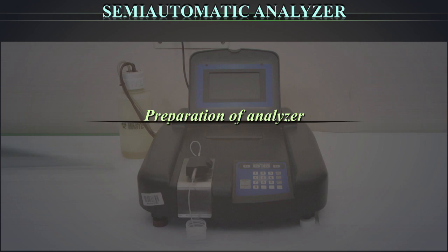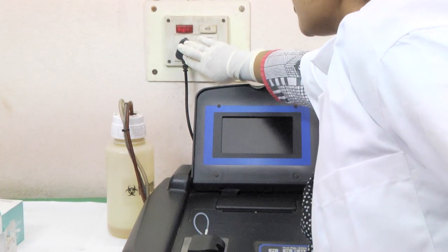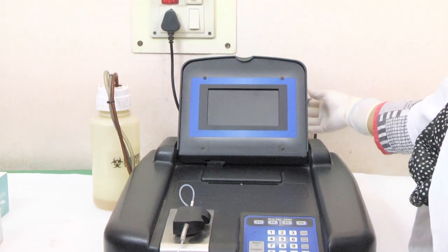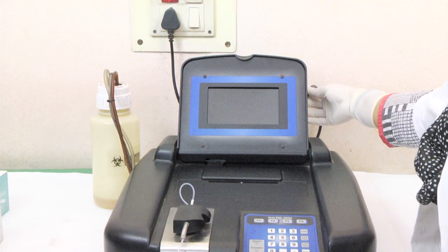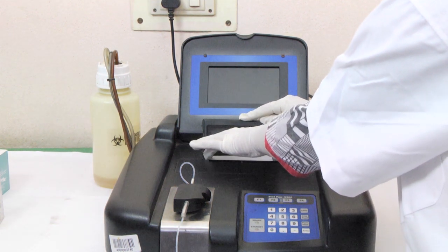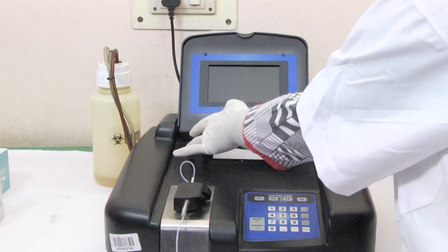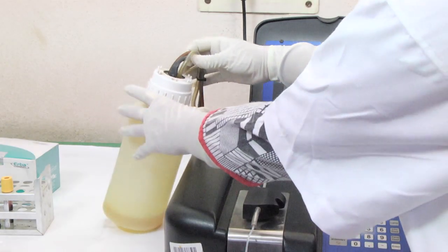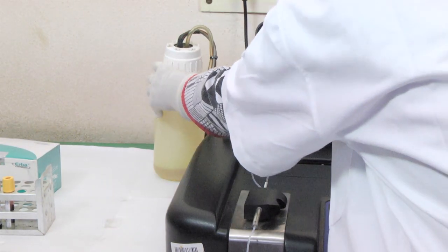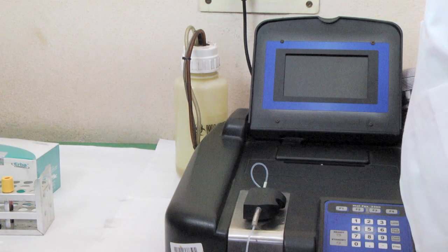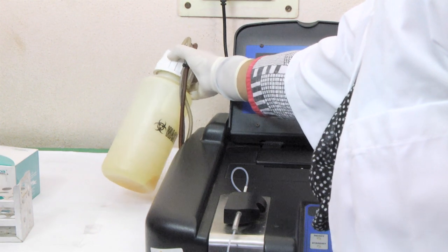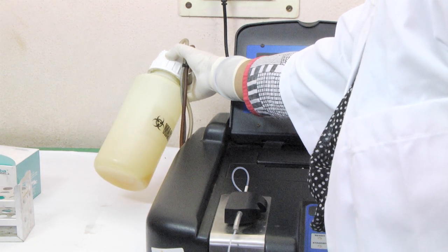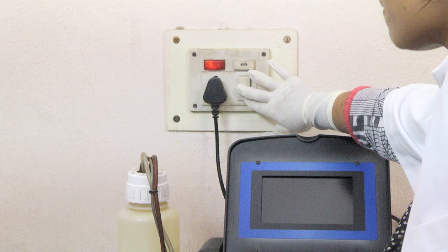Preparation of Analyzer: Check the power supply and make sure it can supply proper voltage for the analyzer. Check if the power cord of the system is properly connected. Check and make sure sufficient printing paper is prepared for the printer; if not, feed more printing paper. Check if the waste tube at the back of the system is connected to the waste bottle or other disposal channels. Check if the waste bottle is full; if yes, empty the waste bottle.